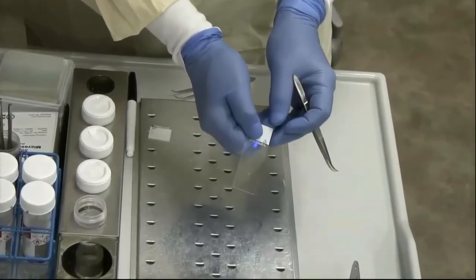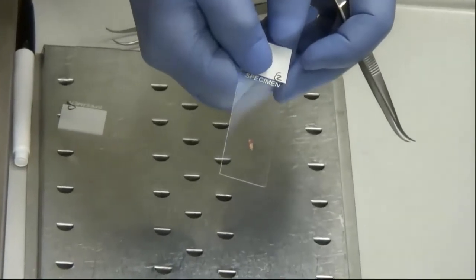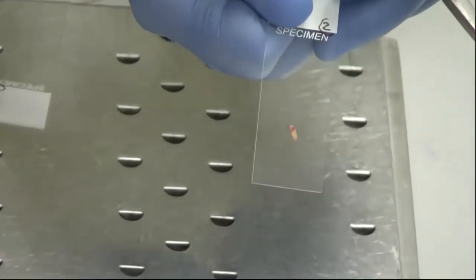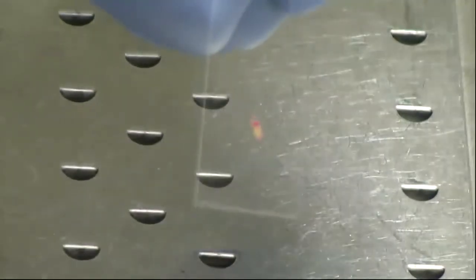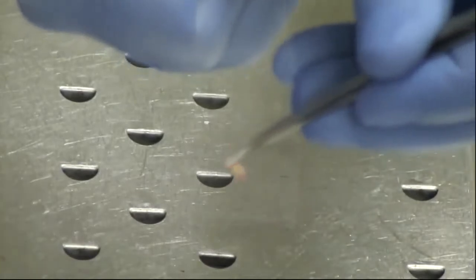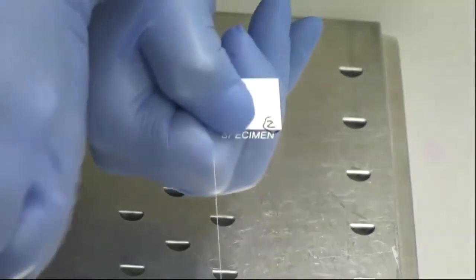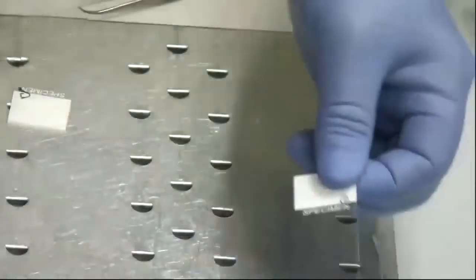So, Stephen, we're going to go back to Conrad on the overhead camera. Zoom in, please. Can you see the little biopsy specimen on the slide? It gave a very nice bite with the SpyBite Max biopsy forceps. So Conrad is again just going to gently roll it over onto the slide and then stain it, and we'll have a look at the first bite under the microscope very shortly. Okay, so we're now going to go back to Dr. V. Please, Stephen.